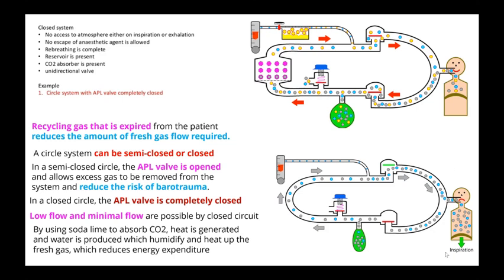Another, what is happening in this picture? It is written here also. Patient is in inspiration, that is inhaling. So the gases are going here. There is no leak in the expiratory valve or APL valve.